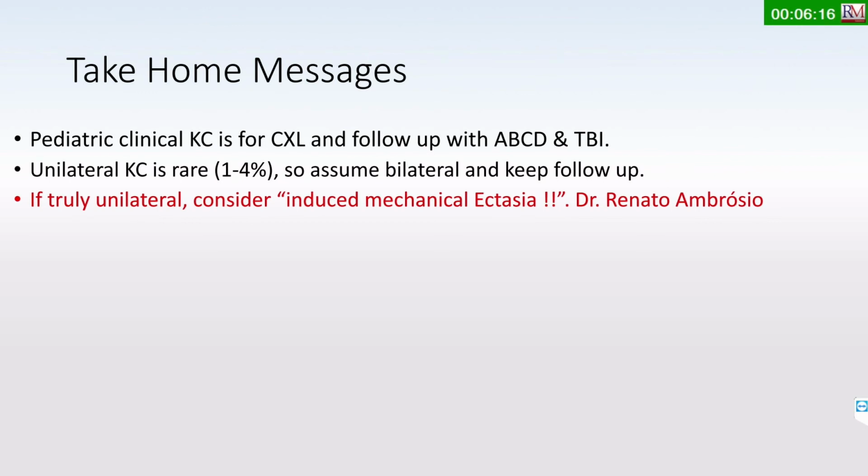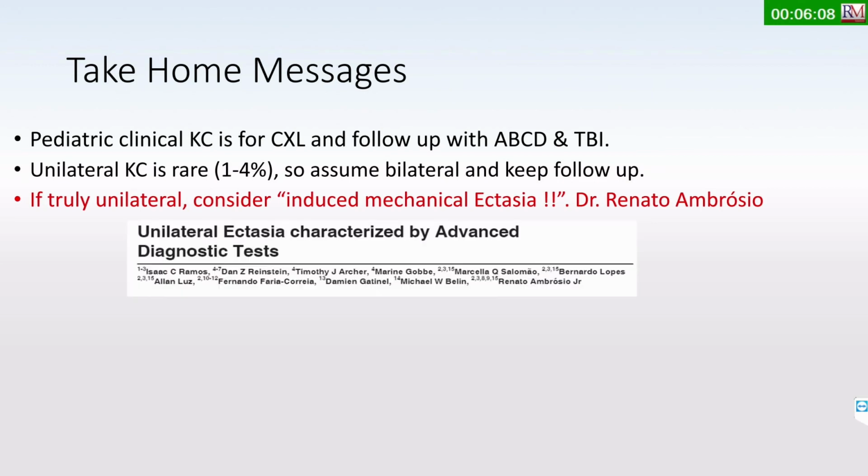Actually, this is not a case of unilateral keratoconus. This is a term called induced mechanical ectasia. It was described by Dr. Renato Ambrosio and some authors back in, I think, 2017, when a case of unilateral corneal ectasia was diagnosed like this case. Actually, this is not keratoconus.